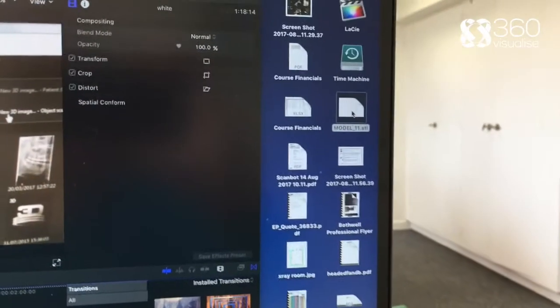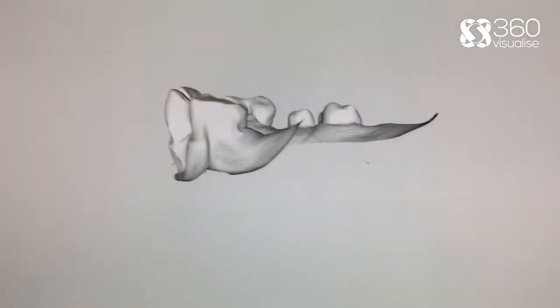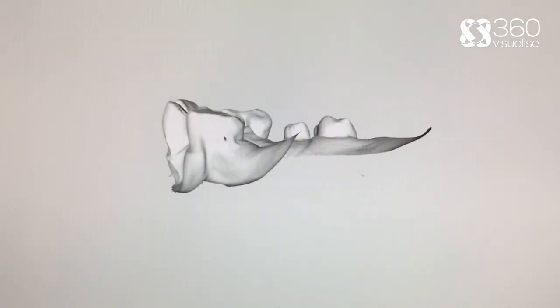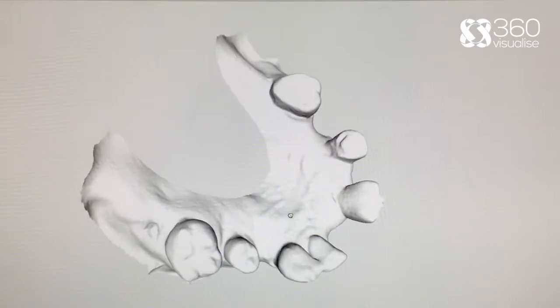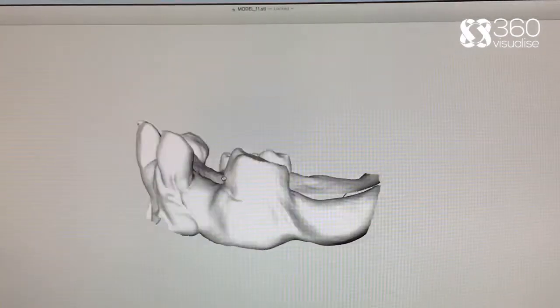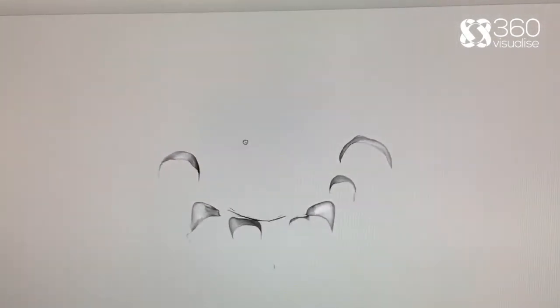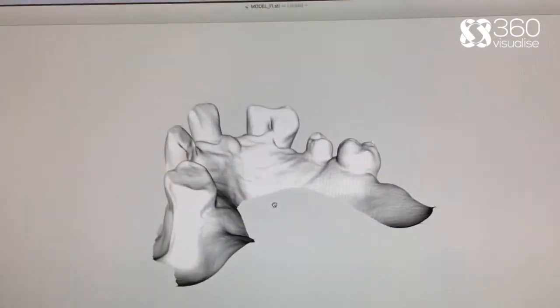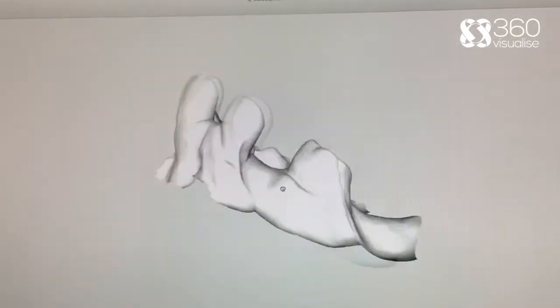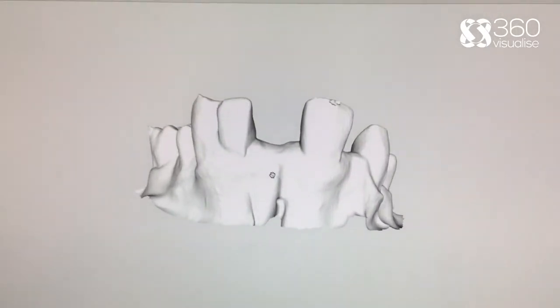So here we are now with the STL that we've converted, and this is just the open STL on my Mac. I'll put a link up to this so you can download the STL and have a play with it yourself — but nothing fancy, just an old impression that I found lying around. Alright, cheers.